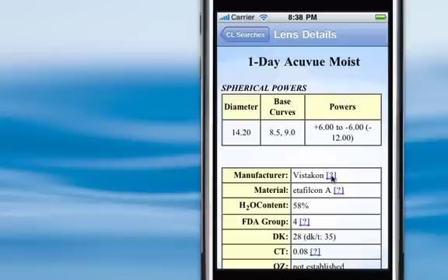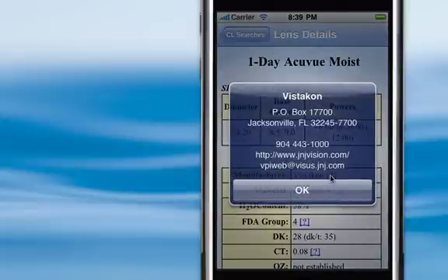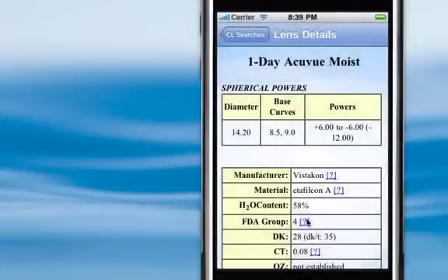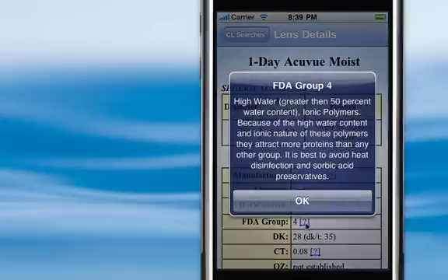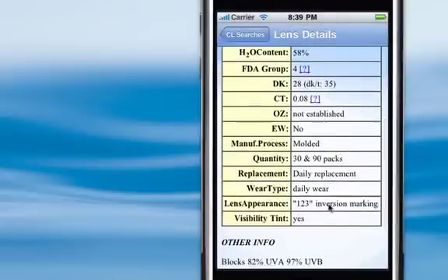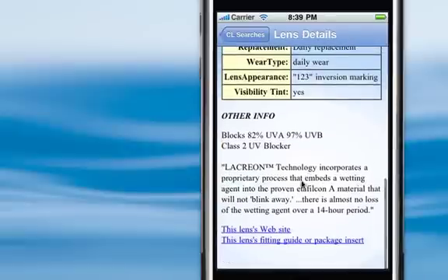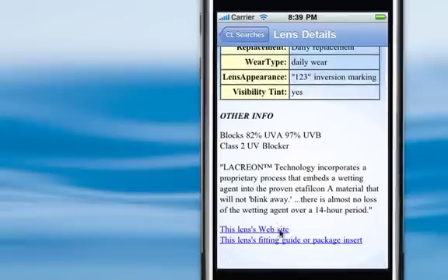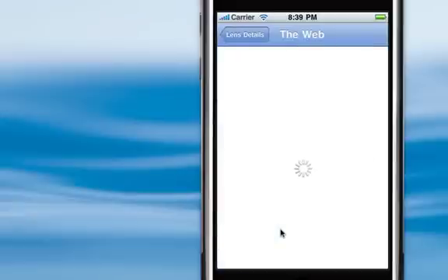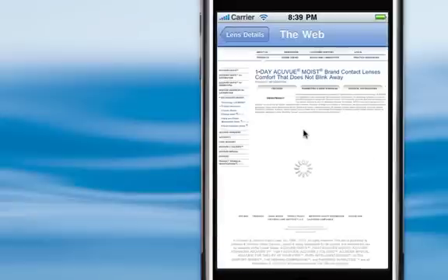Extra information can be accessed by clicking on these question marks. So if you want to know Vistakon's contact information, it'll show you that. If you want to know what the FDA Group 4 classification is, it'll give you information about that. And there are also links to the company's website, the lens's website, or fitting guides.